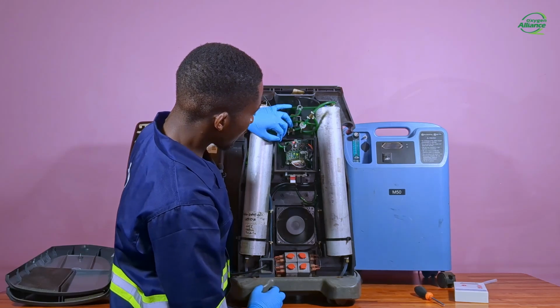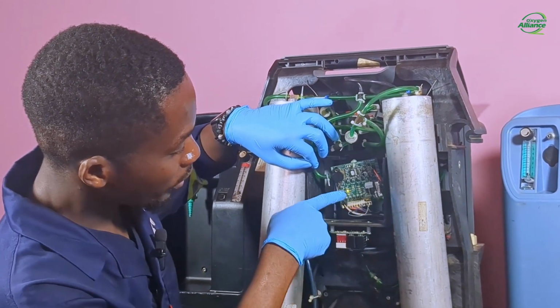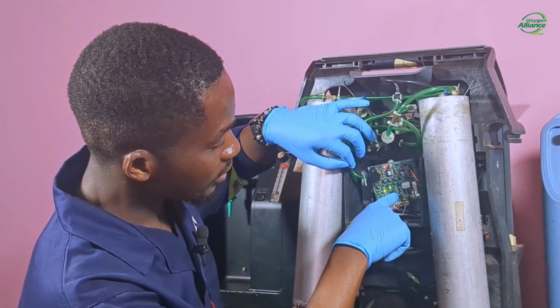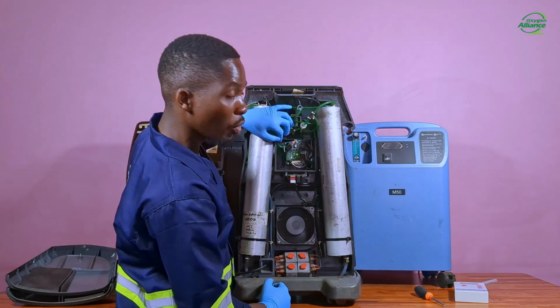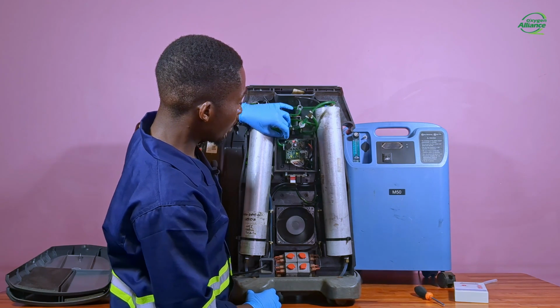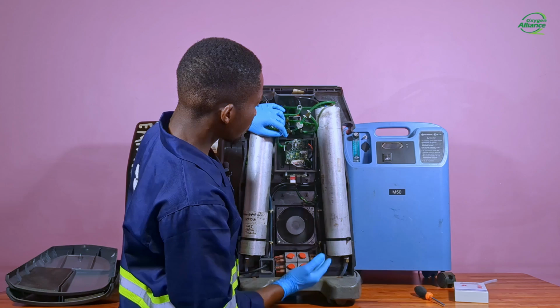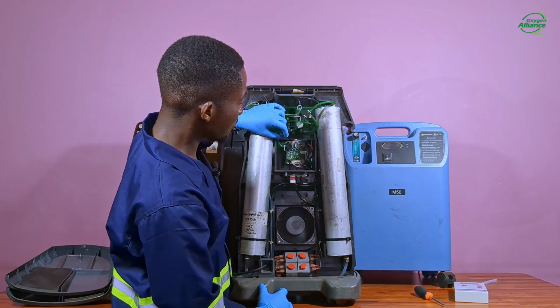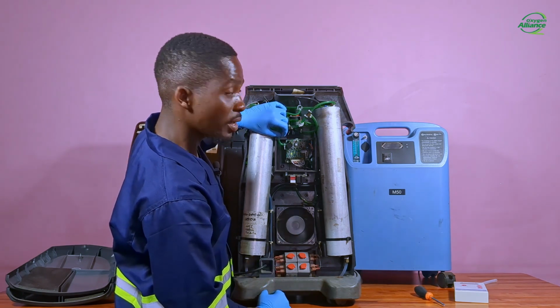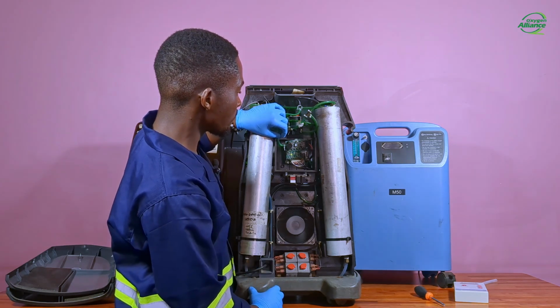So as you can see, this LED has to light up together with this feed LED, and as you can see, it's not turning on. So there can be so many issues that are associated with that, and one of them can be a faulty valve, and also the board itself can be faulty. So I'll turn off the machine and then explain in detail how you can troubleshoot this problem.